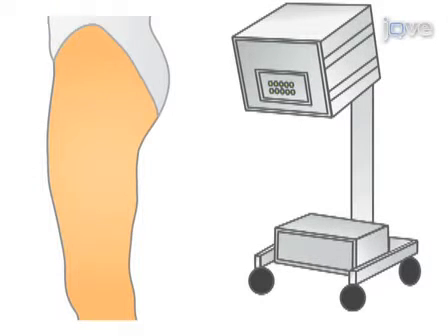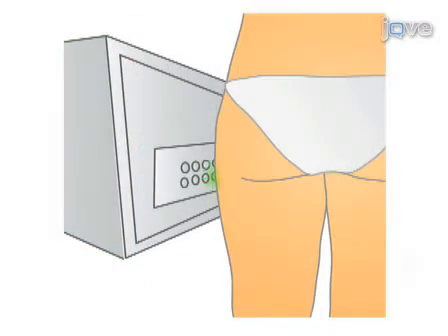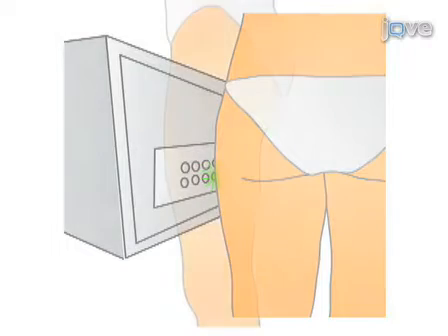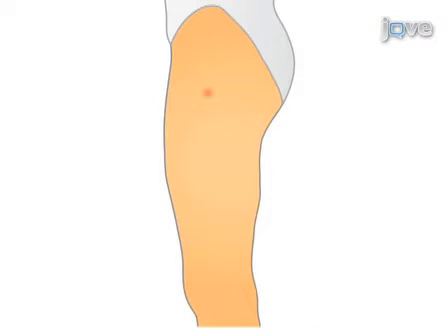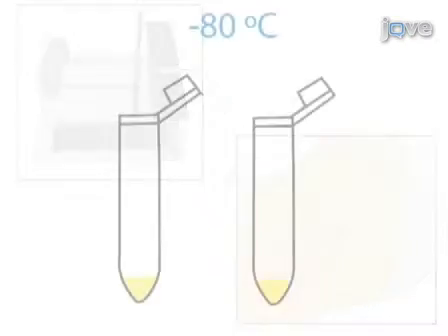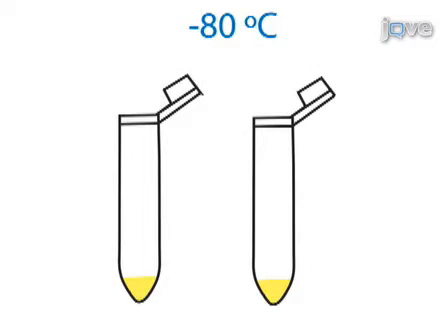This video begins 24 hours after the induction of the experimental sunburn on the thigh of a patient using a calibrated UV light source. After application of local anesthetic, a microdialysis catheter is inserted between the cutis and subcutis and is then pulled through the skin. A perfusion syringe is attached to the proximal end of the catheter, and the activation of the perfusion pump will induce the flow and collection of microdialysate. Following collection, samples can be stored at -80 degrees Celsius until analysis of nociceptive and inflammatory mediators is ready to be performed.